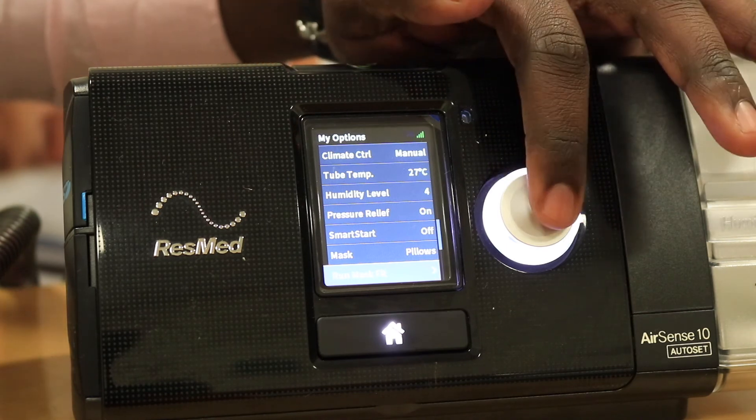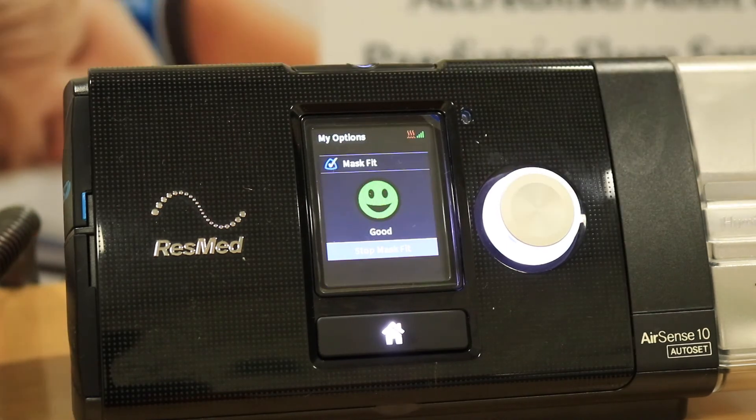To get the pressure going, just press the dial and that will apply the fixed pressure. Allow a couple of seconds for the pressure to build up and just breathe normally.